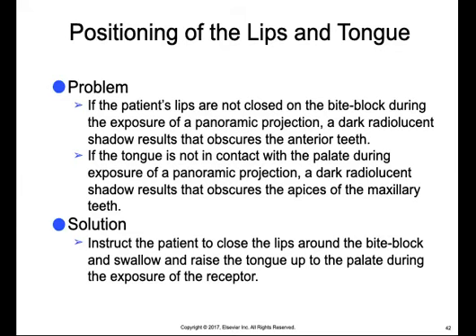And a solution or a way to prevent this is to make sure you instruct the patient to close the lips around the bite block and to swallow and raise the tongue up to the palate during the exposure of the receptor.